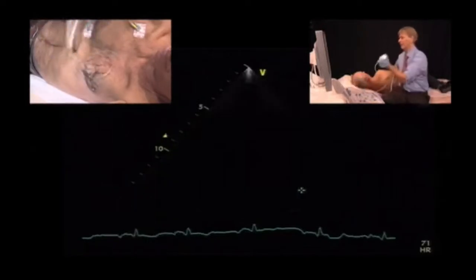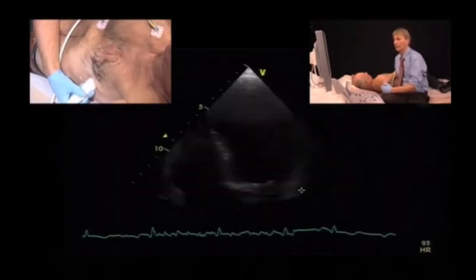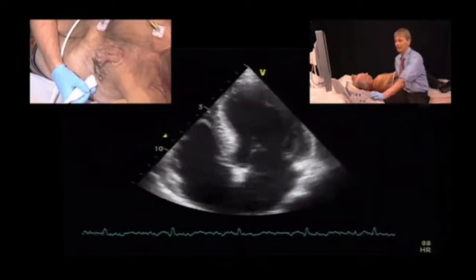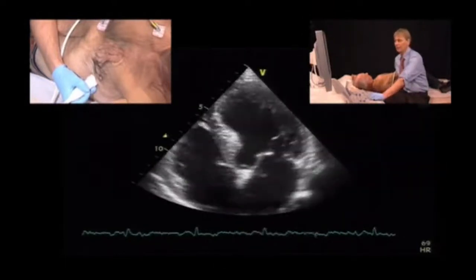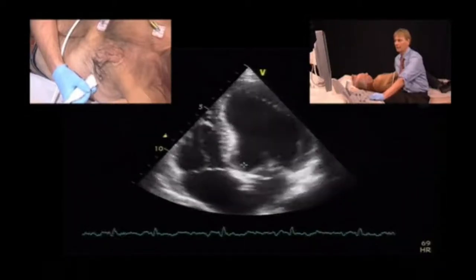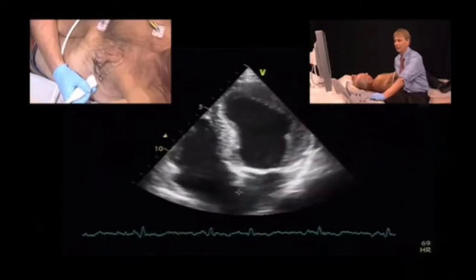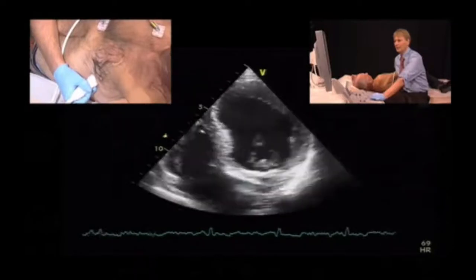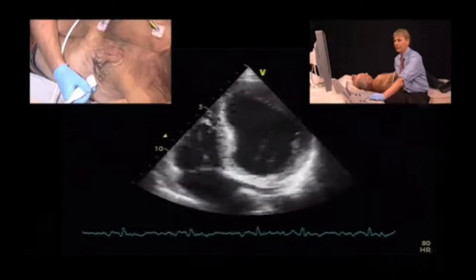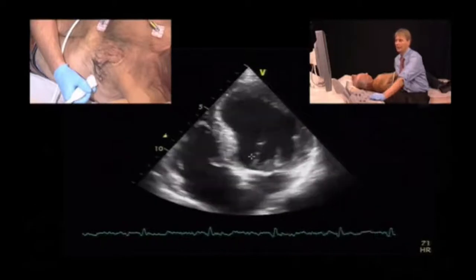Let's now go to the apical views, which usually show us even more. Usually gives us more information about the regional wall motion abnormality. And in the four-chamber view, we see that there's fairly normal contraction here in the lateral wall, apex, septum, but the basal inferior septum does seem to have a problem. You can notice that if you tilt the transducer downwards, you see the coronary sinus here, so we're in the coronary sinus view. So these are the basal inferior portions of the interventricular septum, and there is a wall motion abnormality here. However, the septum does still have a normal thickness.